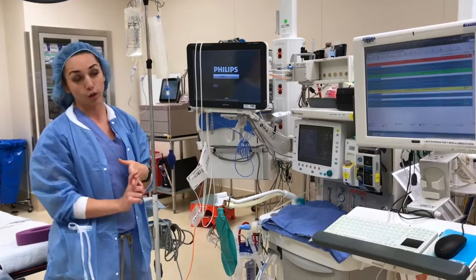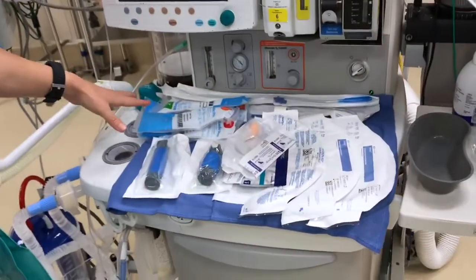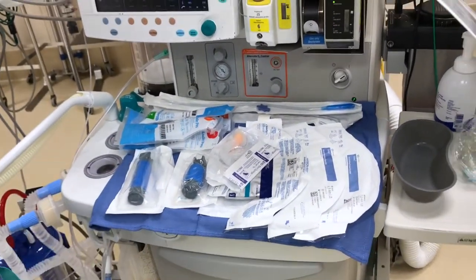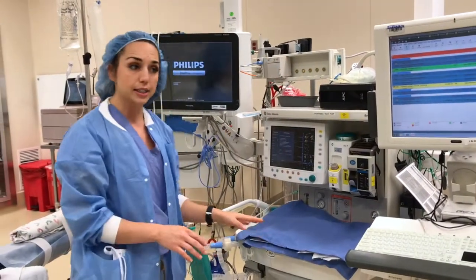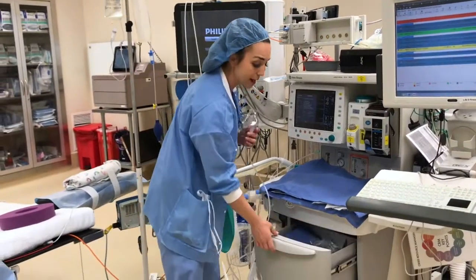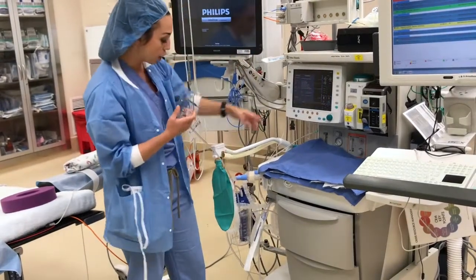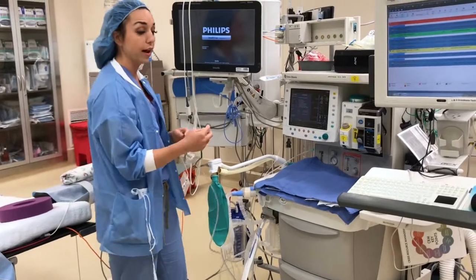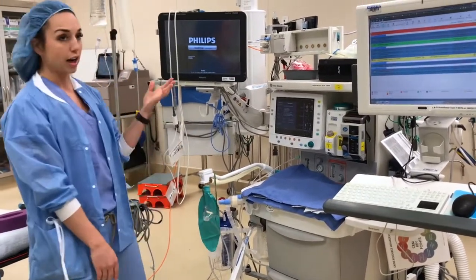Machine, suction, monitor, airway. You should have at the beginning of the day your airway equipment already set up. So just make sure and take a look under the towel when you get in. Usually just make sure that you have everything that you need for airway. And then for the C-sections at least, most of us like to use a mask or a nasal cannula. Your face masks can be found right on top here in this drawer. And then we just hook it up and set it to the side. And we'll talk about when you want to apply that mask. So machine, suction, monitor, airway, IV. We already spiked our IV bag.